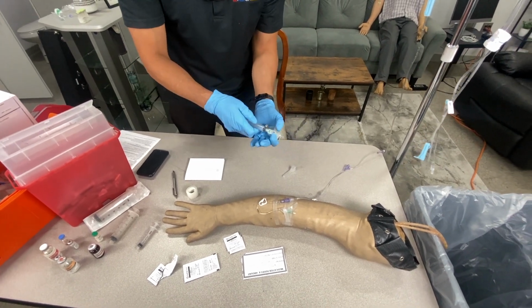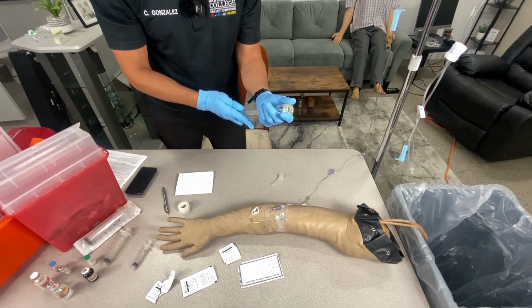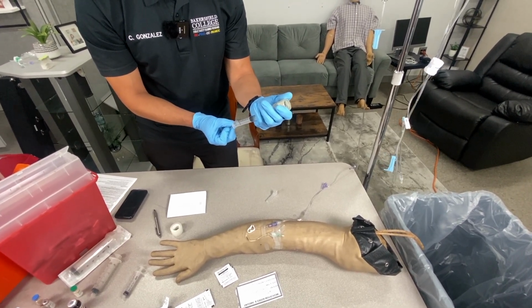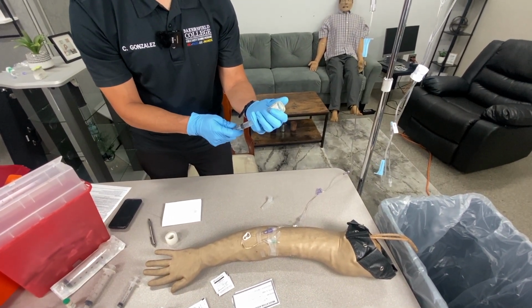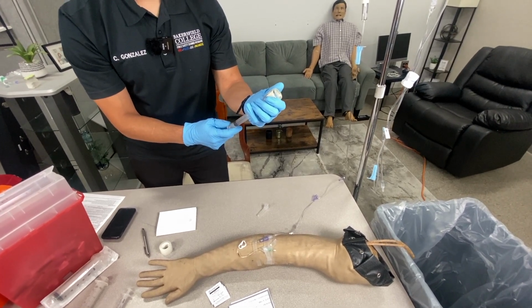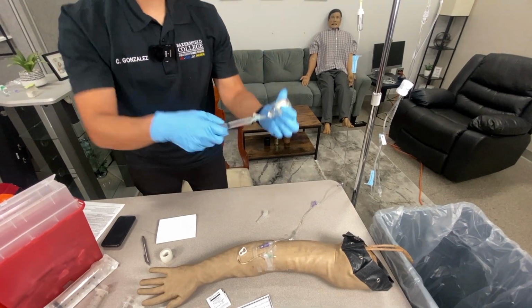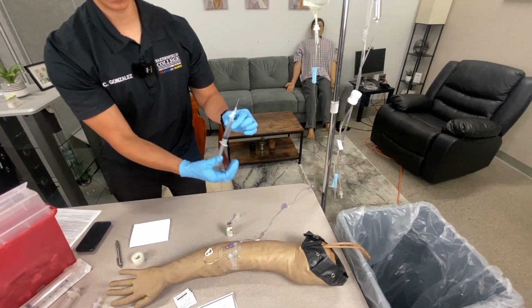I am going to withdraw the proper amount of fluid, which is going to be 10 mLs, to make up 400 milligrams of dopamine. All right, 10 mLs.